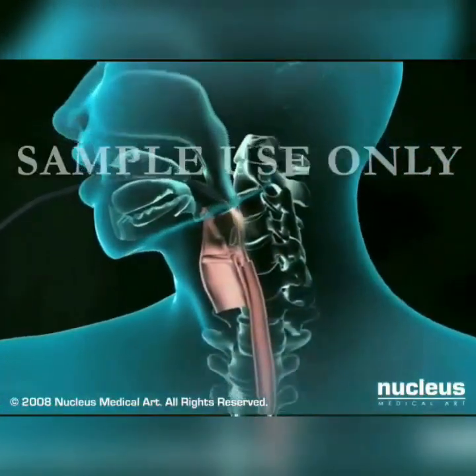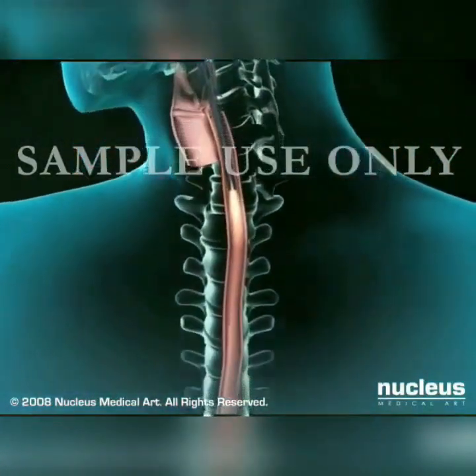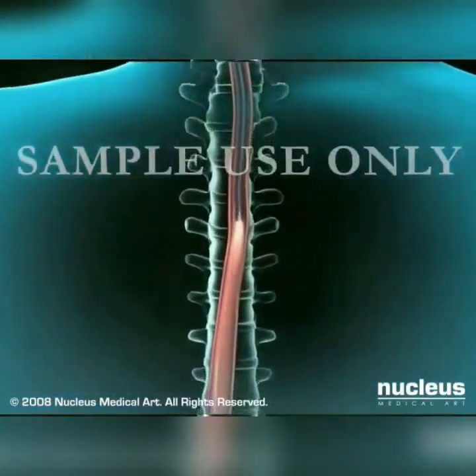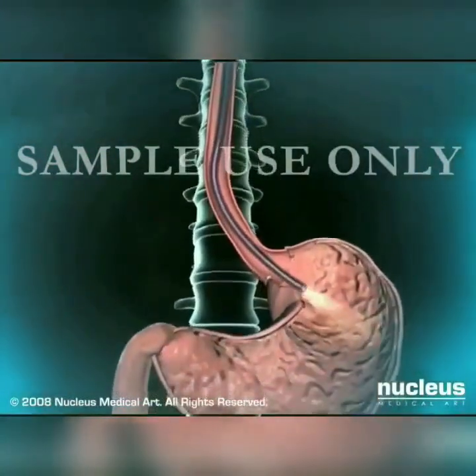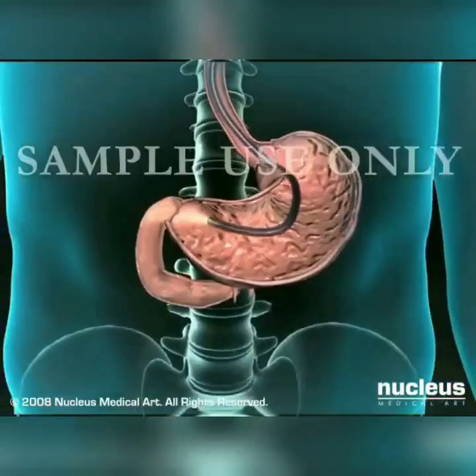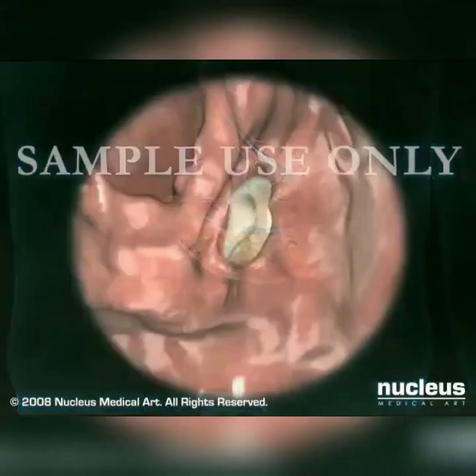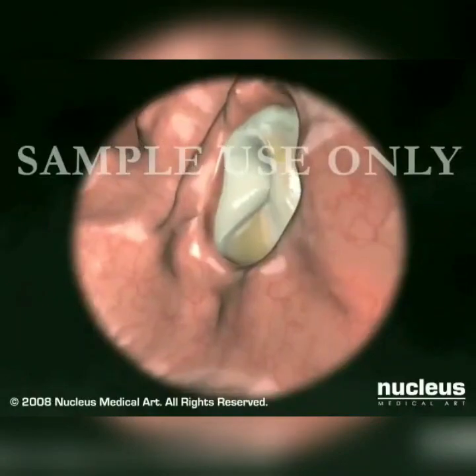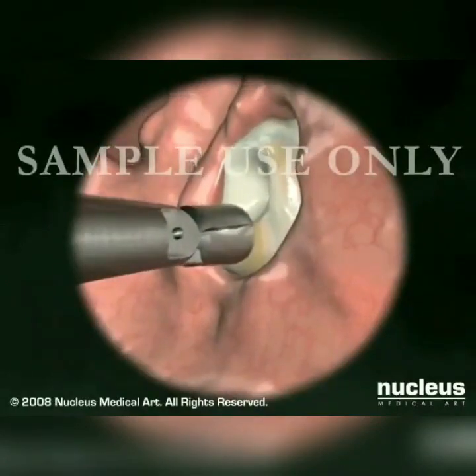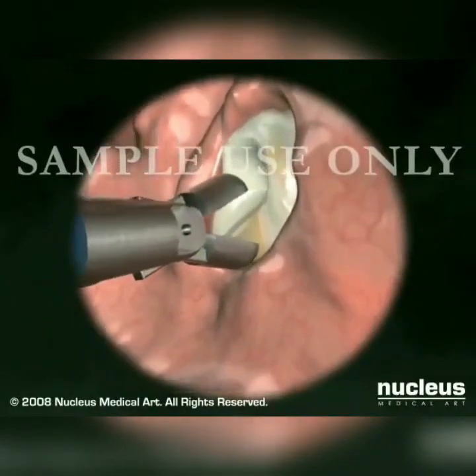Your doctor will gently insert the endoscope through your mouth and then slowly and carefully move it down your esophagus until it reaches your stomach. And finally, your duodenum. You should feel no pain as this is happening. Your doctor may periodically introduce a small amount of air to flatten the mucosal lining and improve visibility.